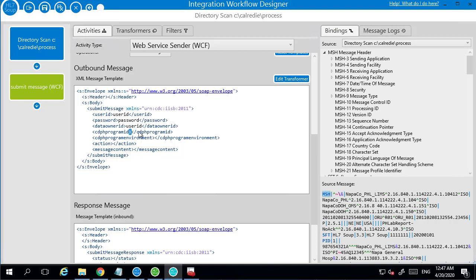The program ID, I'm just sending it to one. So the CalReady LR is one, CAIR is two, and CCR is three. The environment, production or test. P for production, T for test. And the action I'm going to do is send. You could also put in a query there, if that was appropriate.